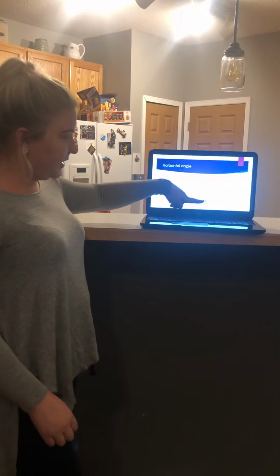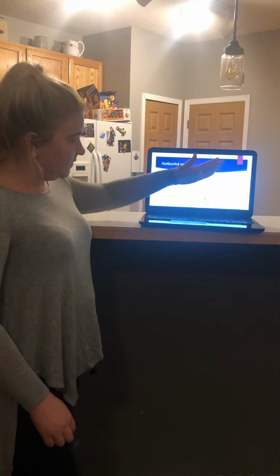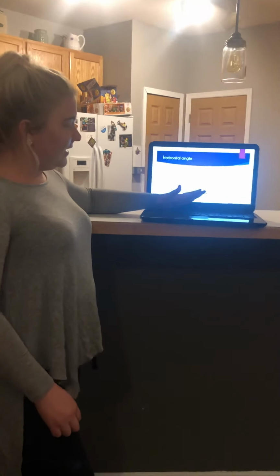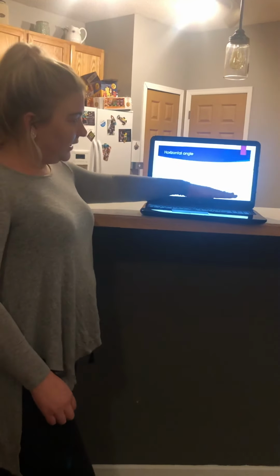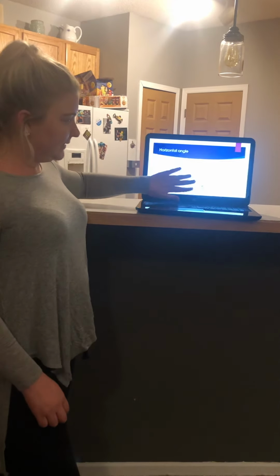So for example, this picture is showing that an incorrect horizontal angle would be going too far forward like this, and then you would not receive the contact points between the teeth. And then correctly, you would have it directly at those contact points, shooting right between the contacts.